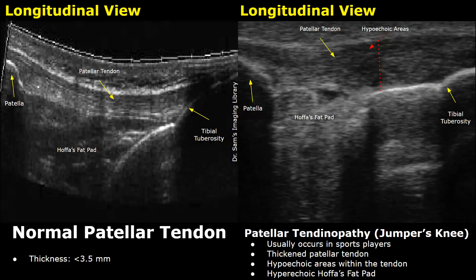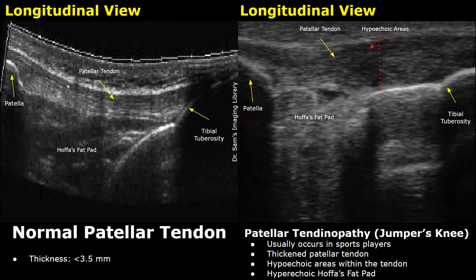This is a normal image of the patellar tendon. This fibrillar structure is the patellar tendon. Overall this structure is hyperechoic and has a fibrillar pattern with alternating hypoechoic and hyperechoic lines. It has a smooth echo texture.